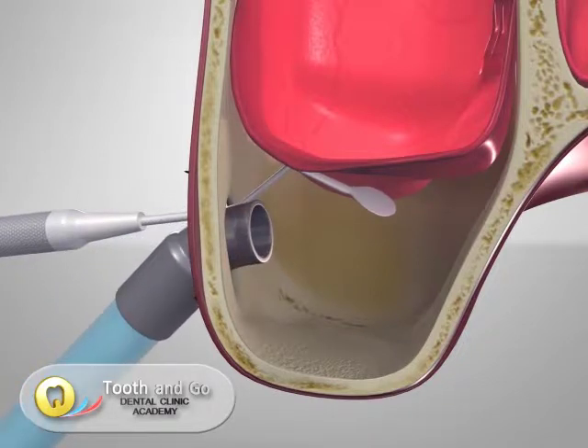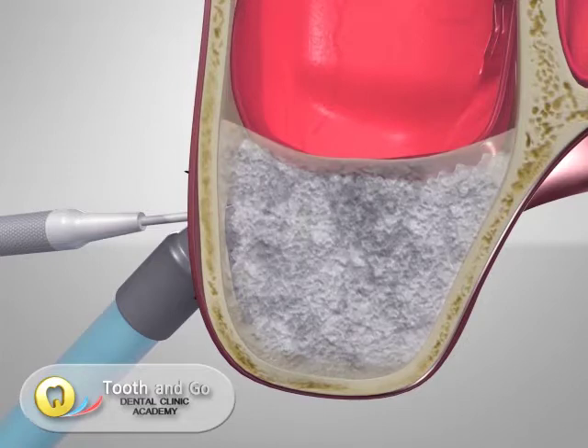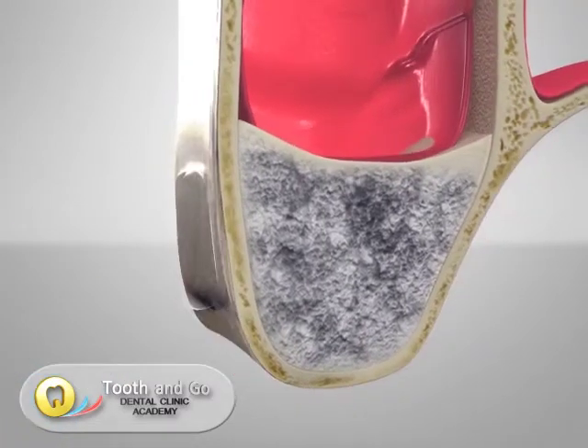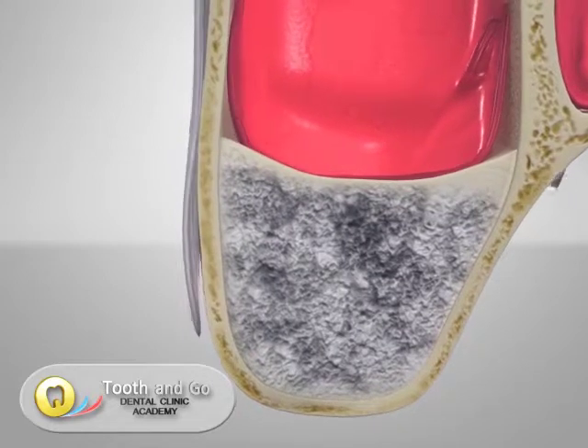Artificial bone replacement is filled into the gap between the floor of the sinus cavity and the membrane. The main purpose of the artificial bone is to lift up and hold the sinus membrane in position so that new bone can form underneath.